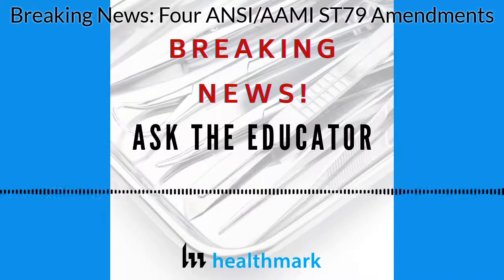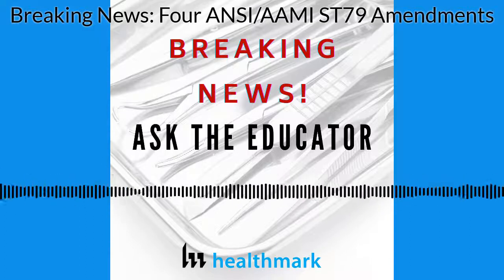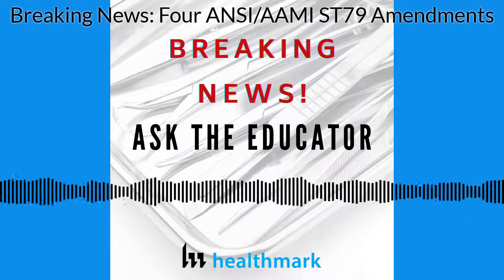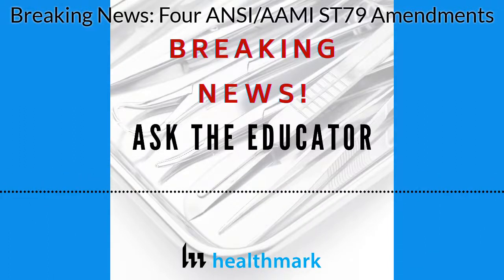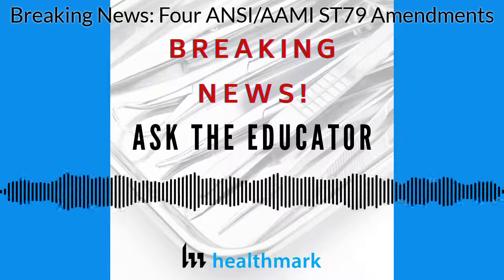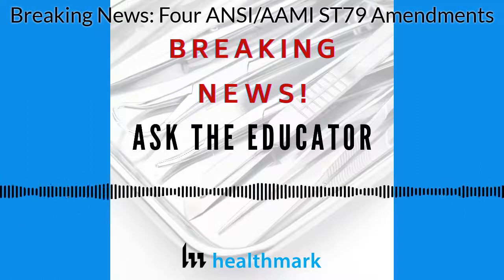This one has to do with routine care and cleaning of your sterilizer equipment. This one provides a list of items that should be inspected visually according to the manufacturer's IFU. These items could include the printer ribbon, or maybe the ink cartridge, as well as the general cleanliness of the internal surfaces of the sterilizer itself. So if you notice that there's discoloration or staining that's observed on the inside of the sterilizer, then that manufacturer's IFU should be followed on how to clean those internal surfaces of the chamber.